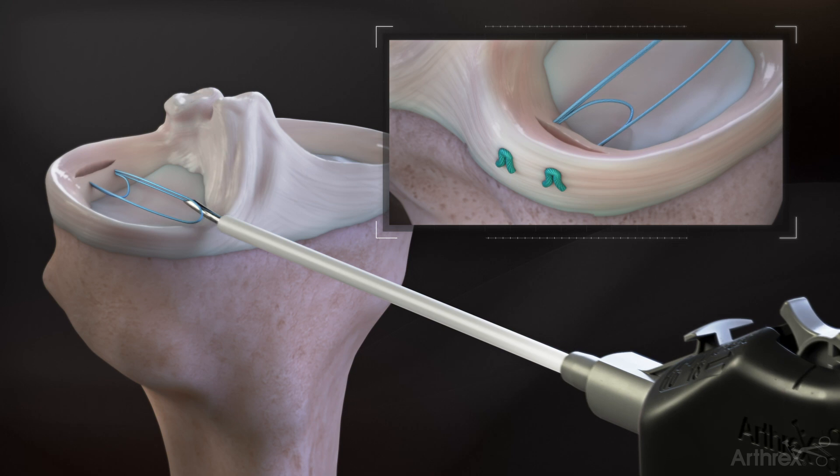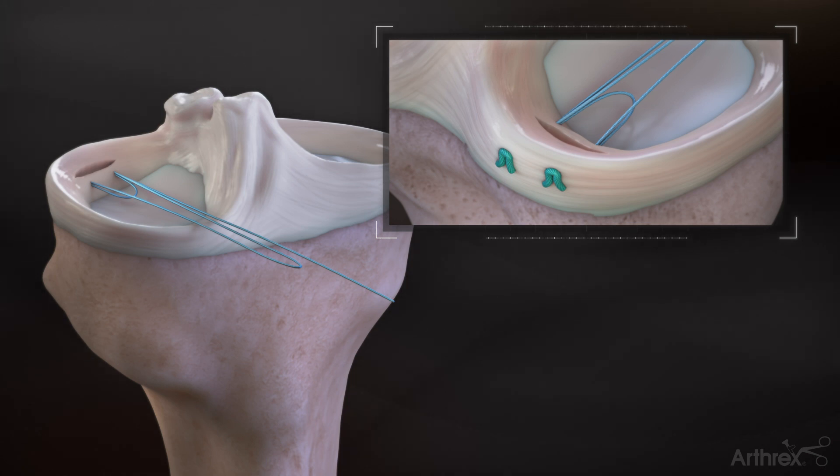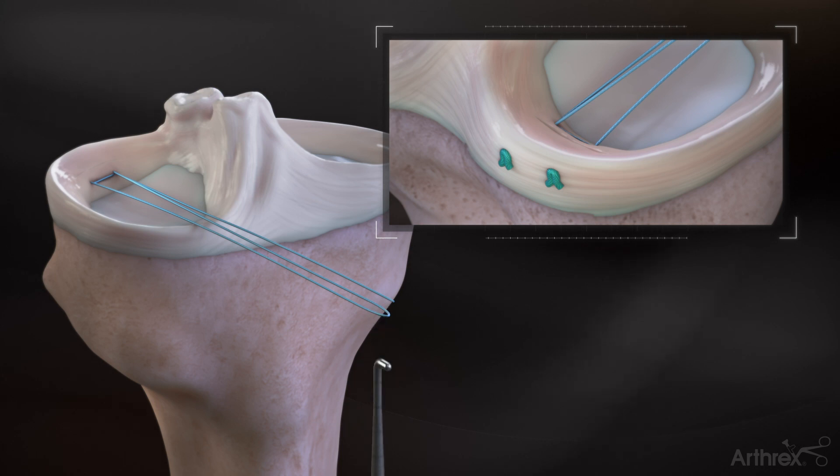Upon removing the device from the joint, a suture loop and a loose end of suture will be outside of the portal. Identify the suture loop. Use a probe or similar device to pull the loop suture to compress the suture anchors.